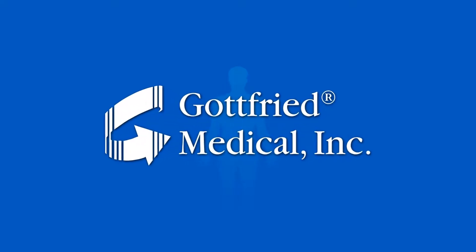This video will show you how to measure for and order a made-to-measure compression therapy garment from the industry's premier supplier, Gottfried Medical.